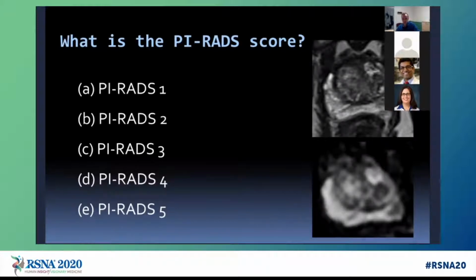So that brings us to our question for the panel. Nicole, it's interesting, you say impeded diffusion rather than restricted diffusion. I think from a physics point of view, that's more correct, but most people use the term restricted diffusion. Is there a reason you use impeded? No, that's sort of the lingo at the University of Michigan. I think I have to credit Matt Davenport for coining that term for me. Physicists, I think that's a more exact and correct term to use, although in the radiology community, often we use restricted diffusion.